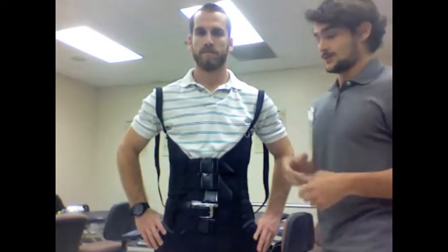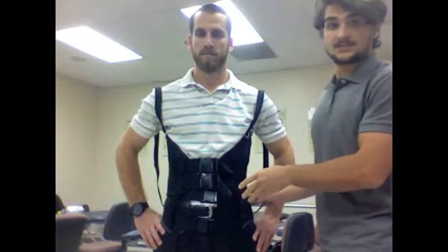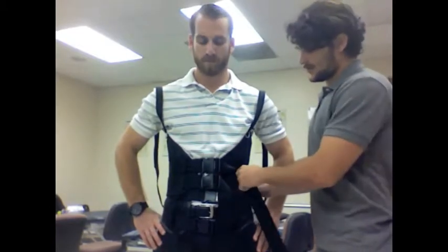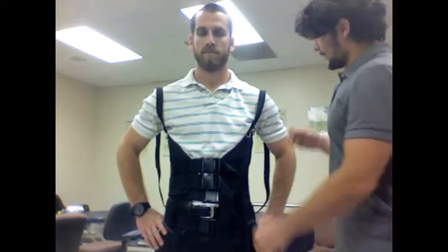For this machine, there are two separate belts. The first one is a lumbar belt, and that's applied first, and the second one is a thoracic belt, which is overlapped on top of the lumbar belt. The first step is setting up while the patient's standing, making sure it's tight enough but not uncomfortable, and then any adjustments can be made once the patient is lying supine.